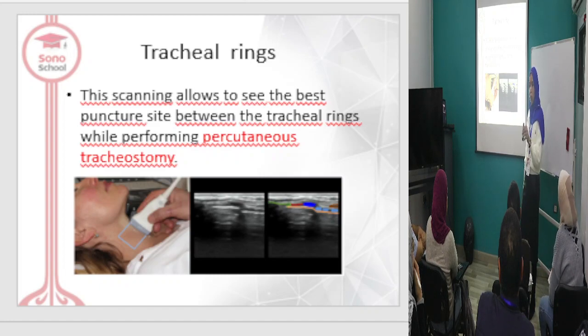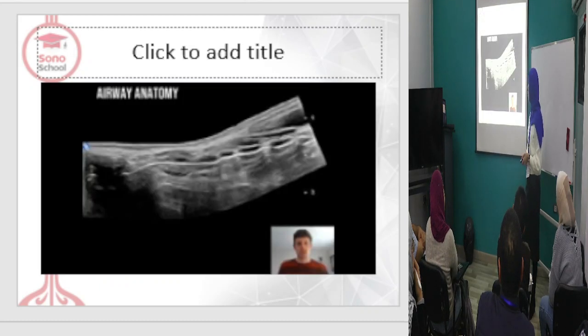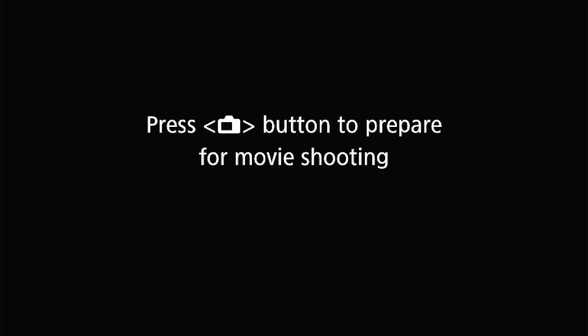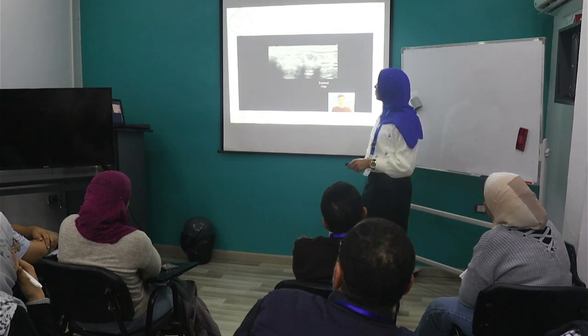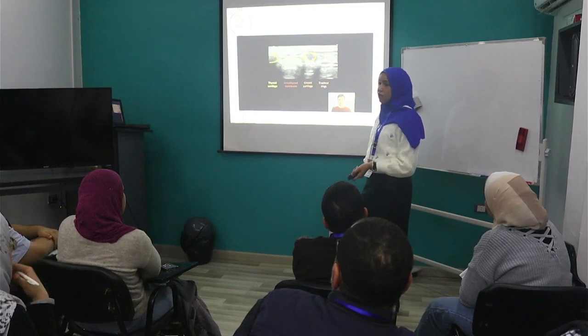It changes the best position to insert the tracheostomy tube. Yes, exactly.